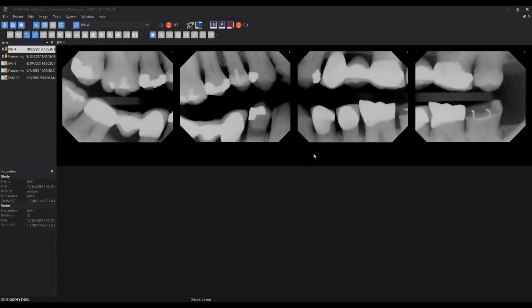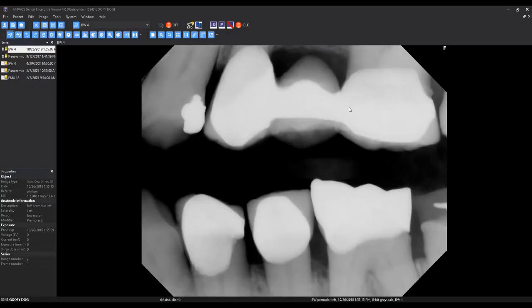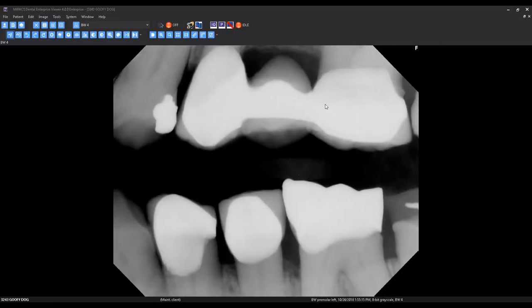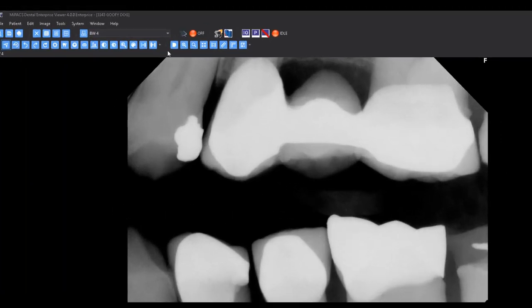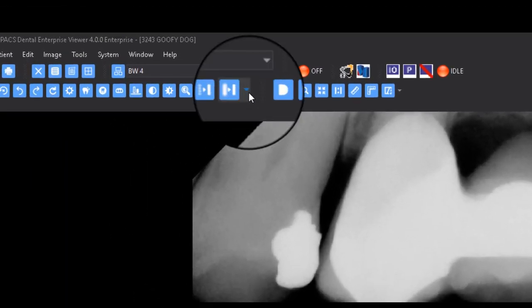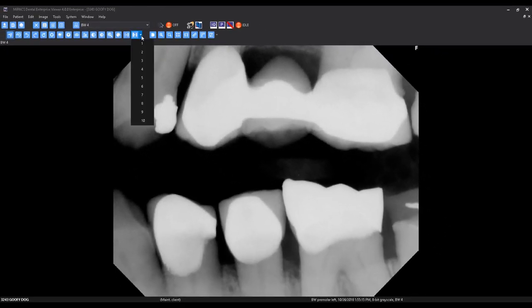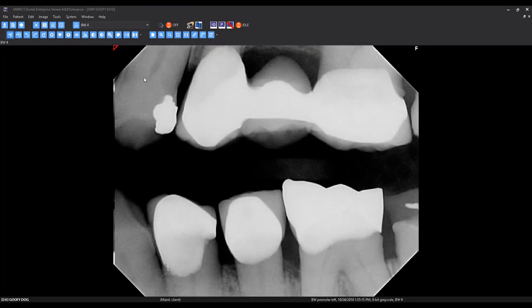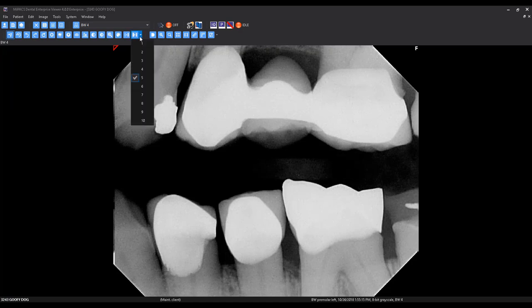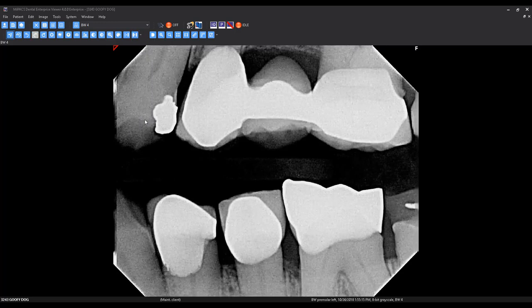The Edge Enhancement tool reduces the blurry edges to crisp, sharp edges. To use this tool, select an image and then click on the arrow beside the Edge Enhancement button to select the amount of sharpness. This effect is cumulative, so caution is suggested. It can be used excessively and ruin the diagnostic quality of an image.